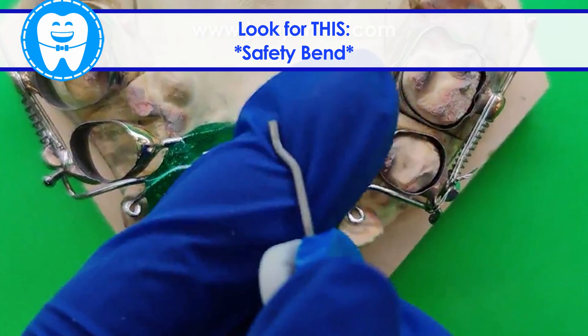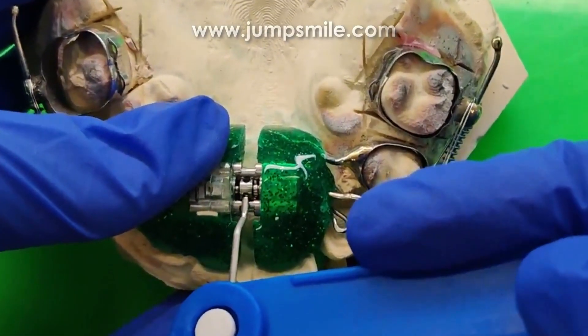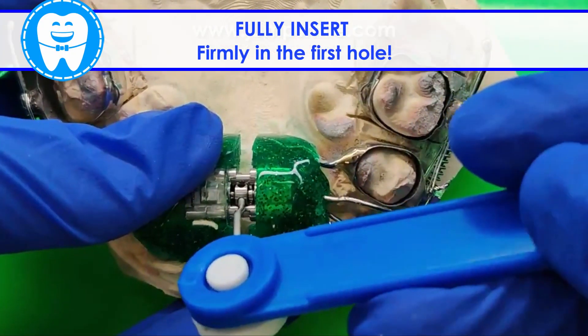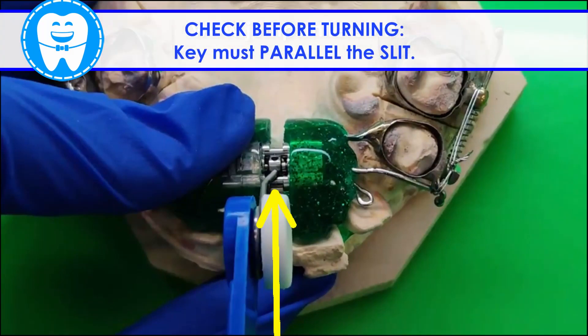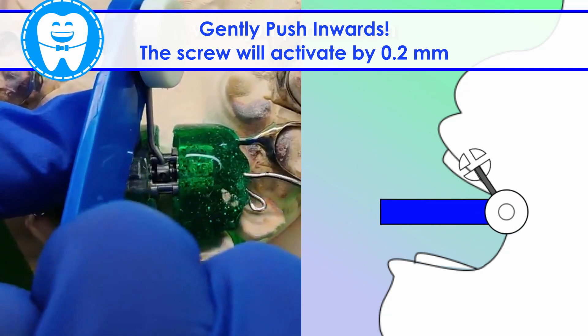Identify the safety bend on your expander key. From the front, look for the first hole. Fully insert the key's tip into the hole. Keep the key parallel to the slit, and gently push inwards.